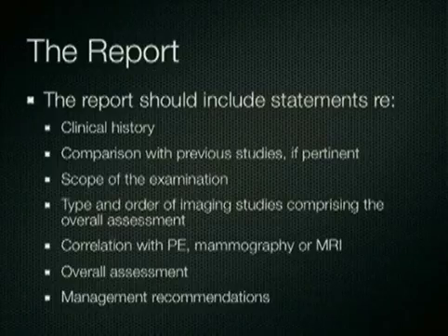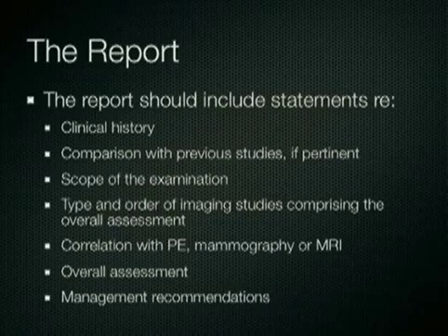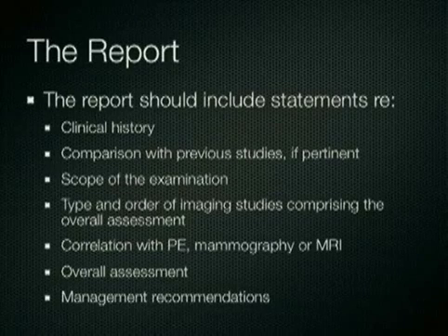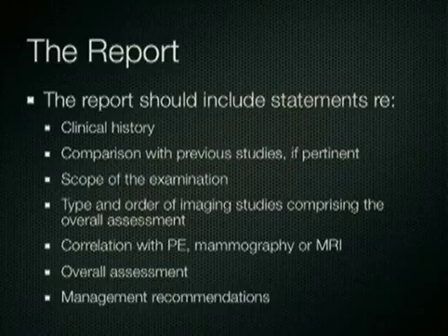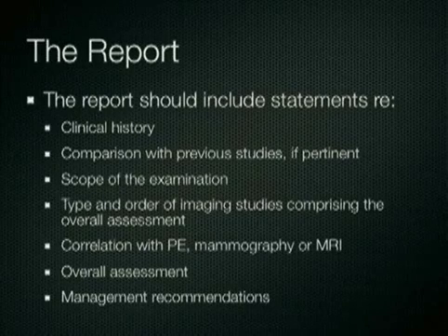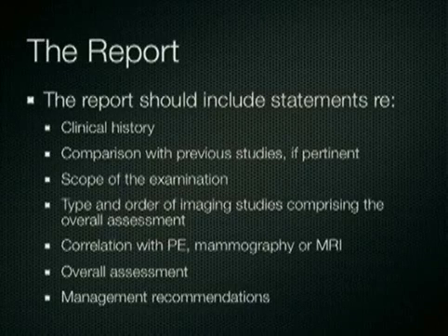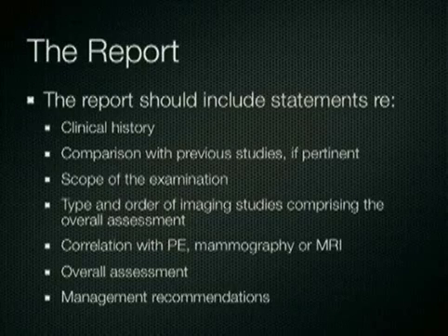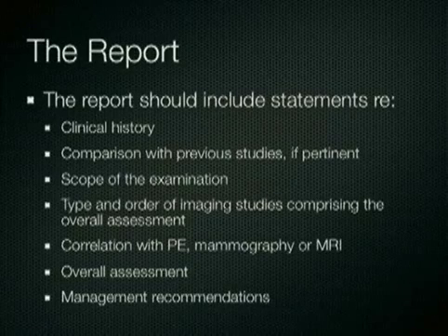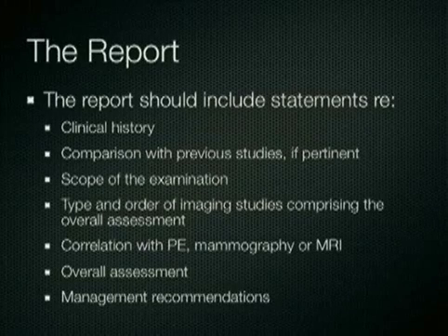The BI-RADS lexicon includes not only description of the features of masses and appropriate terms to be used to describe these features, but also comments on how these terms should be used to generate a final assessment and management recommendation. The report of the ultrasound findings should reference the clinical history, prior studies if available or pertinent, the studies imaged and evaluated, the types of other imaging studies that are included in the overall assessment. Most often this will be mammography, but may include correlation with other imaging studies such as MRI, concluding with an overall assessment category and appropriate management recommendation.